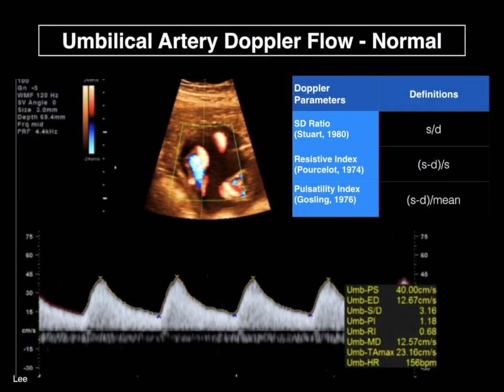Doppler flow measurements of the umbilical artery reflect the downstream impedance to blood perfusion of the fetal placental unit. In order to quantify volume flow, one needs to measure the Doppler flow velocity waveform, the area of the blood vessel, and the angle of Doppler inclination. Unfortunately, direct volume flow measurements of small and spiraling umbilical artery vessels are not feasible.